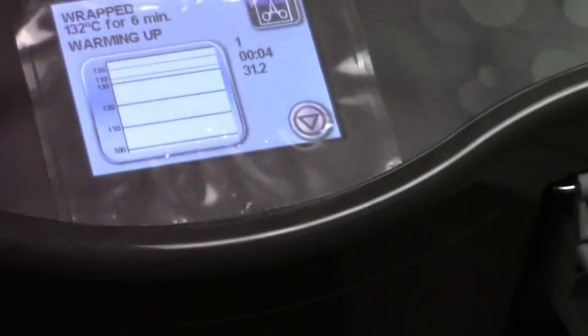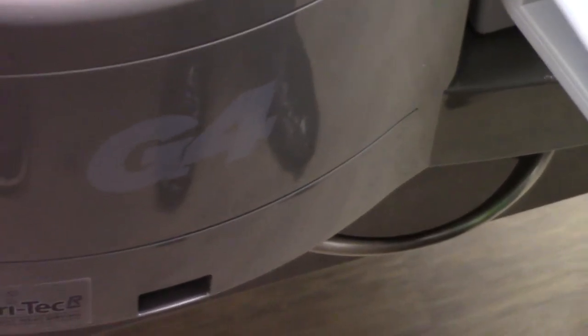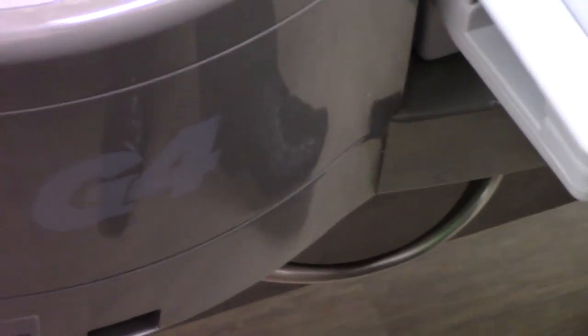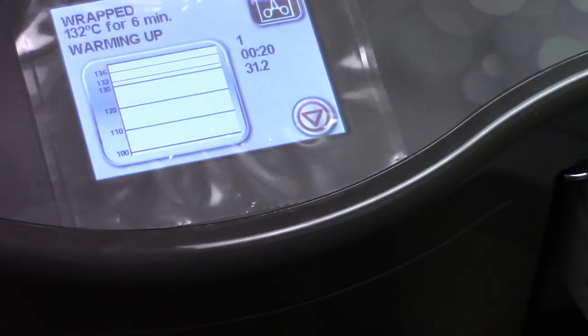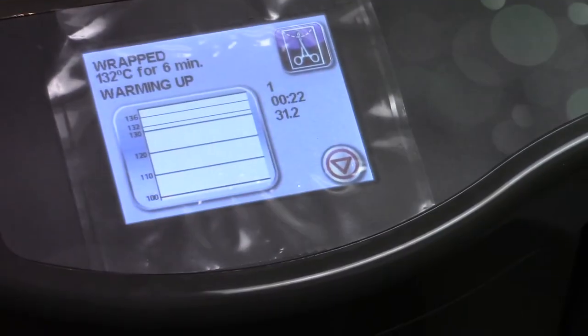So it's just 6 minutes? Yeah, it should be 9. Or it's reps, so shouldn't it be 14? You said 9 and 4, or 13. 14. Yeah, it should be 14. I'm just going to pull up the literature real quick. It might just be the sterilization time, the 14. Oh, and then it comes and pops up after.